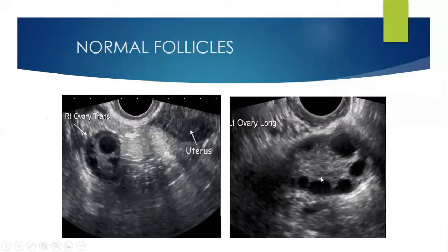Because if you're looking at the ovary in a menstrual phase, and if I want to tell you, okay, tell me what is the antral count for this lady. So how do you count antral count? You will start counting these follicles. These are follicles, 1, 2, 3, 4, 5, 6, 7 in one ovary. And on the other side, in the same ovary, in the other section, 8, 9, 10, 11, 12. So already there you can say 12 antral follicle count. So you can say, oh, it's a very good count.